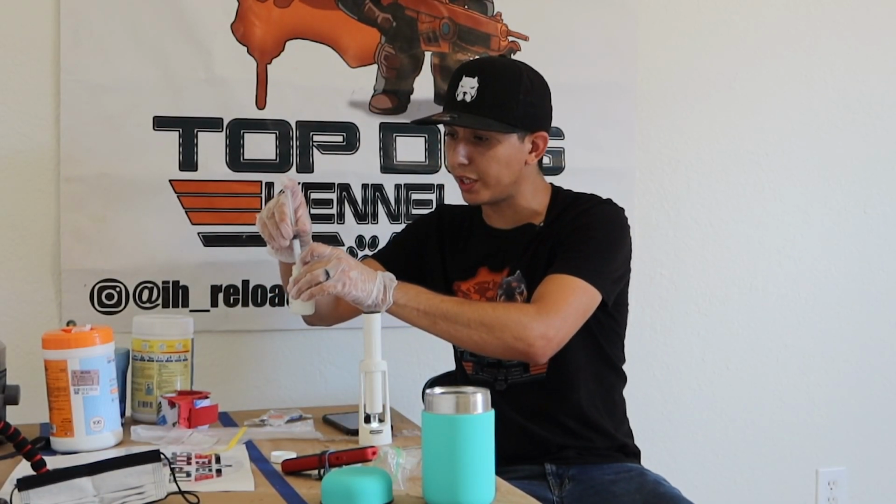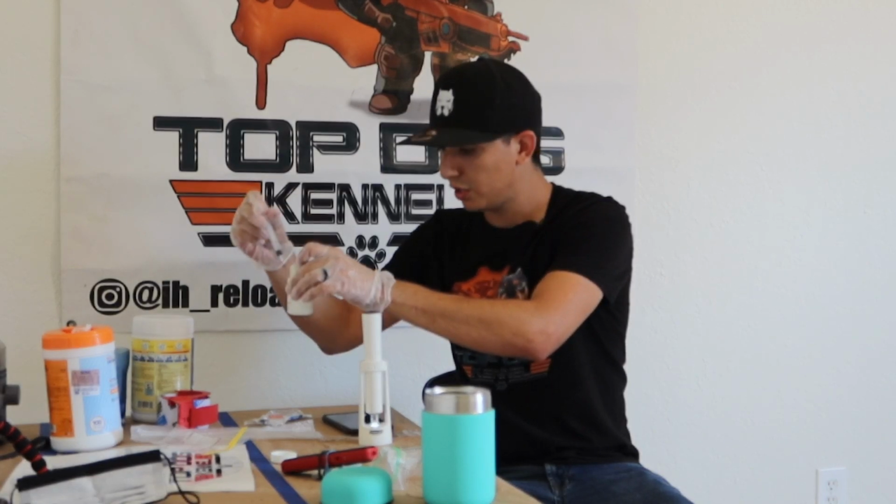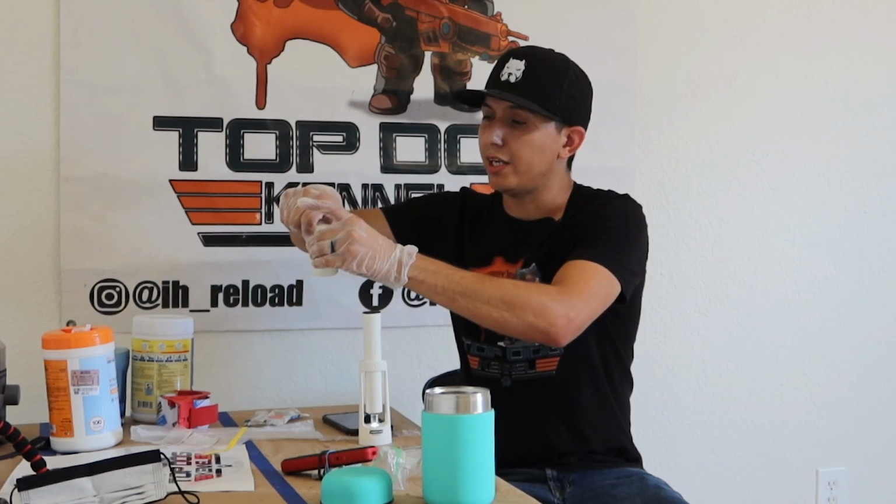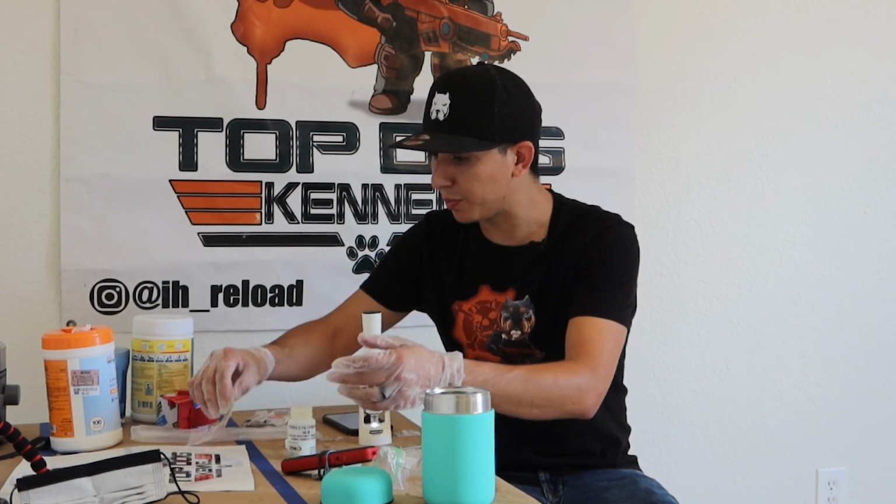This is a sterile container, so you can mix it in here. You want to put the lid on it and gently mix. Don't do it hard, don't mix it rough, because you can damage the sperm cells. You can break their tails or pretty much kill them.